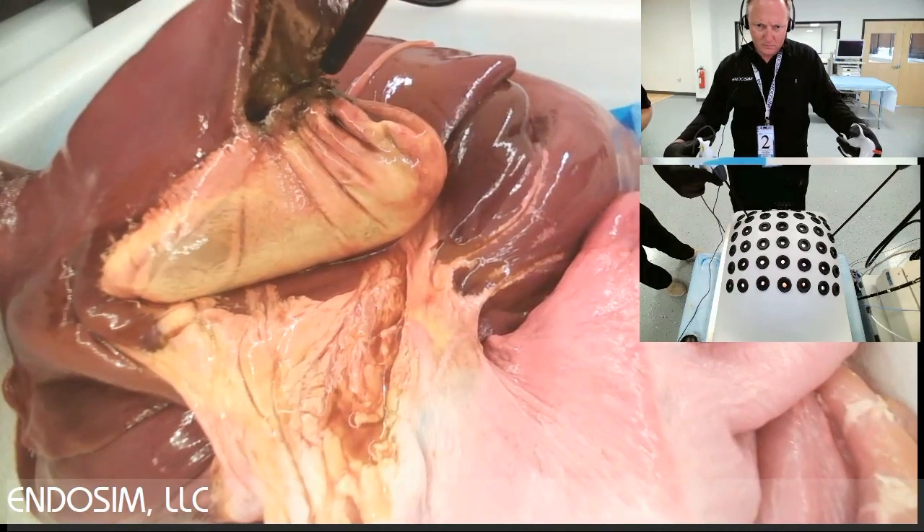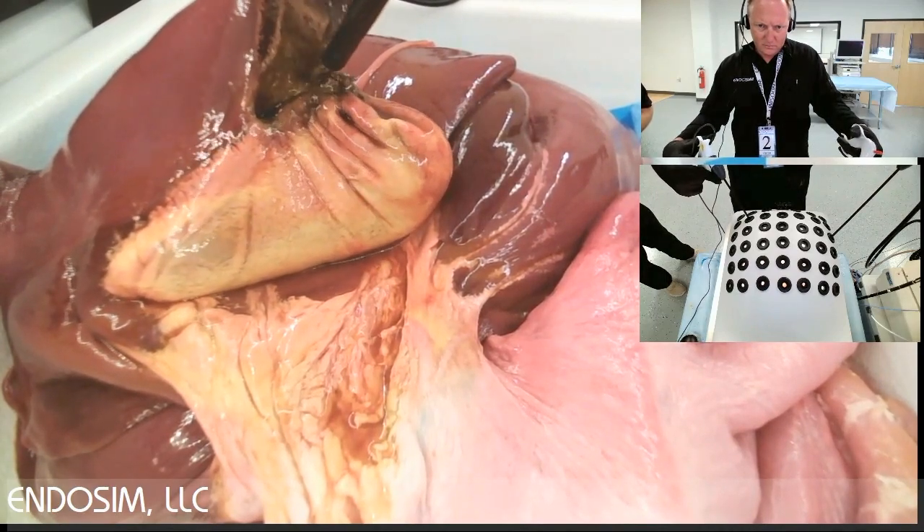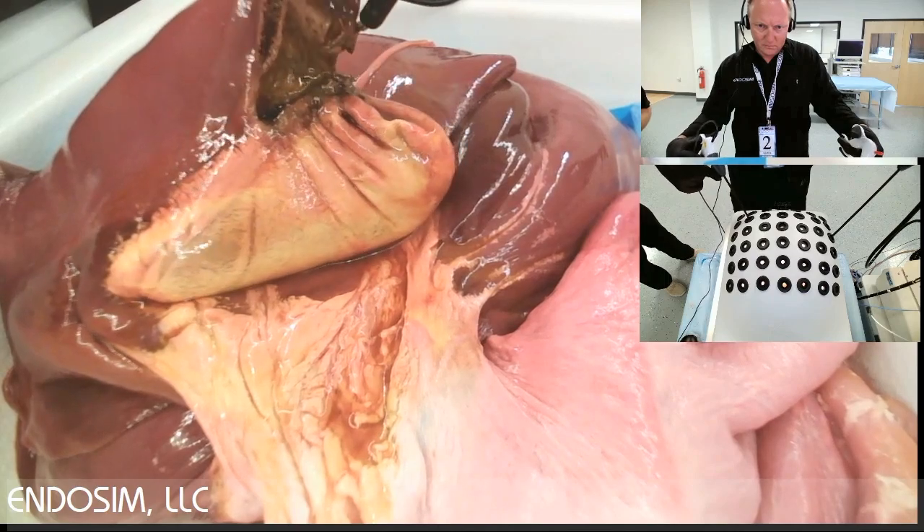The Lab EZR is equipped with a computer to facilitate online virtual training using the Endosim VR training software.